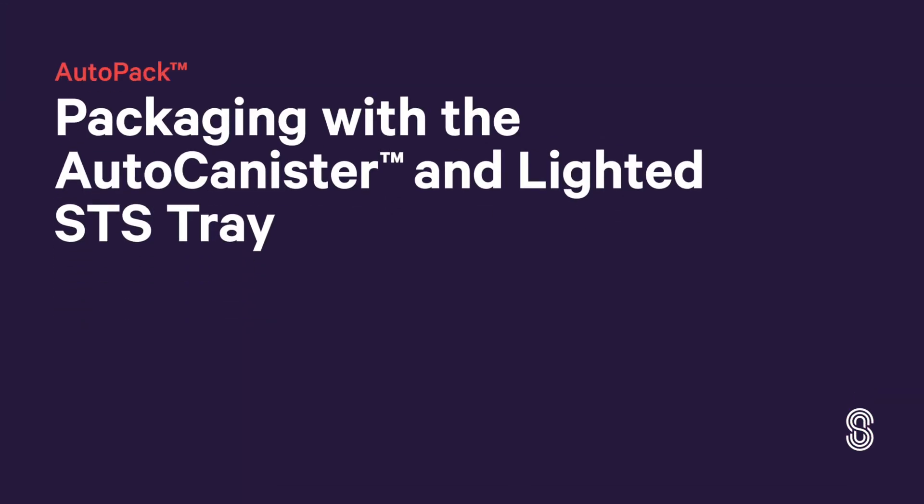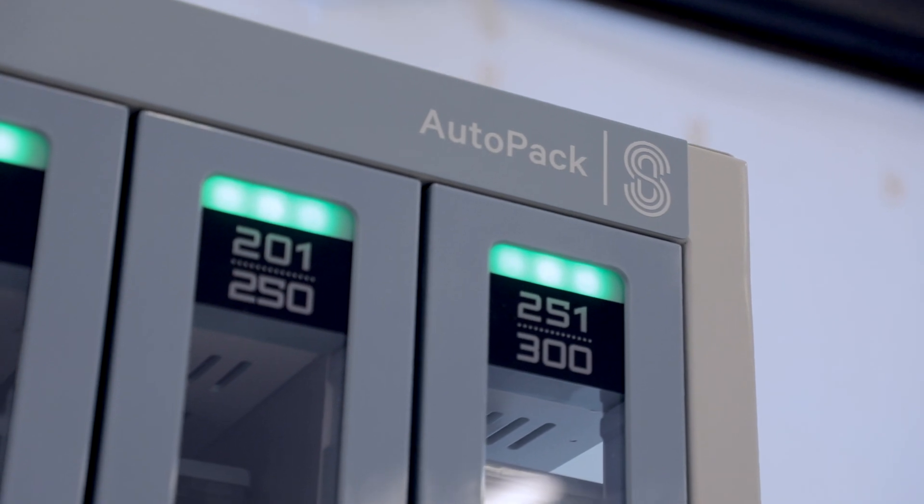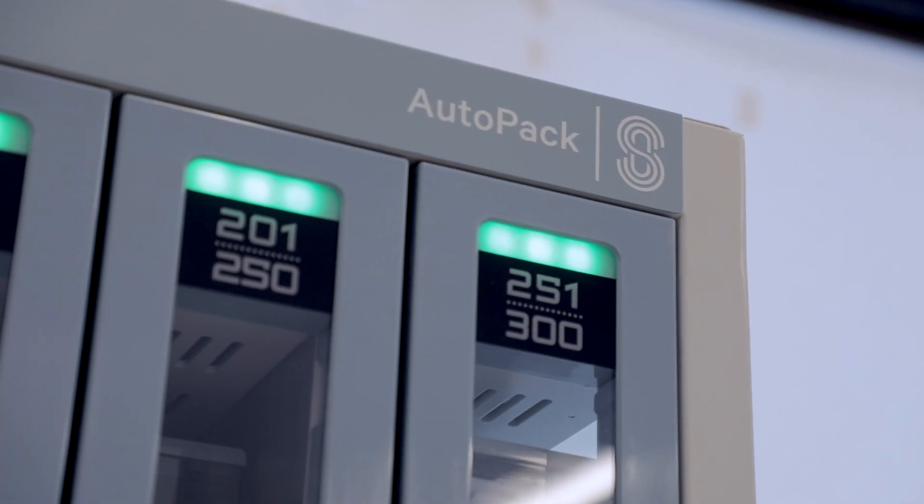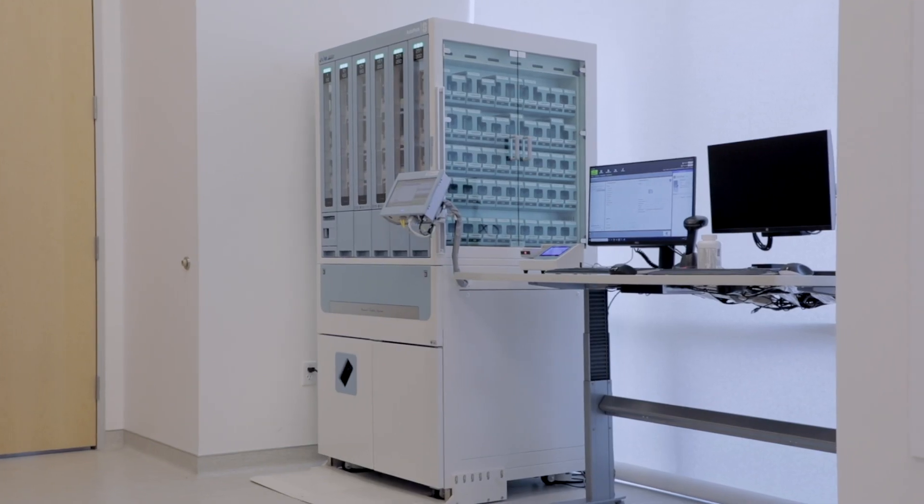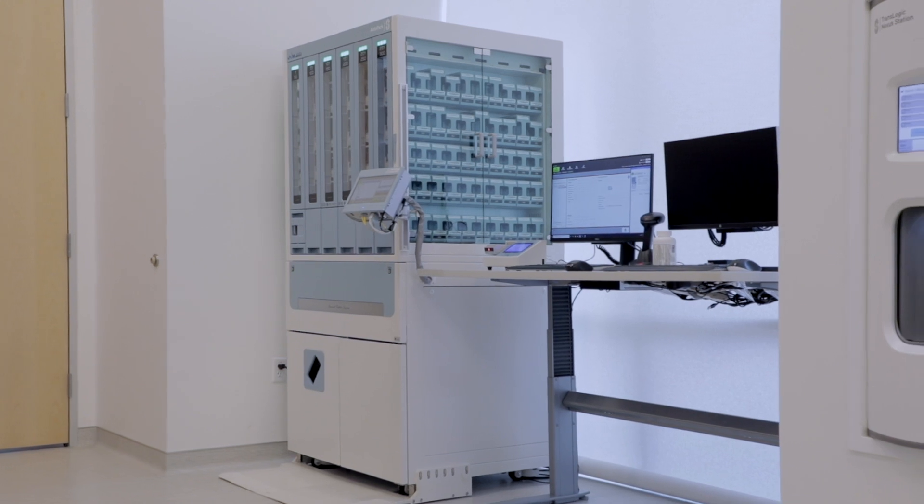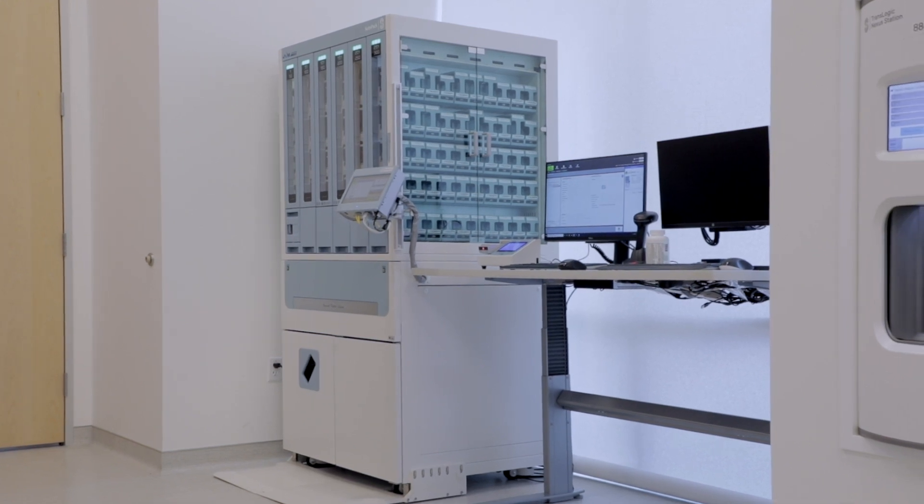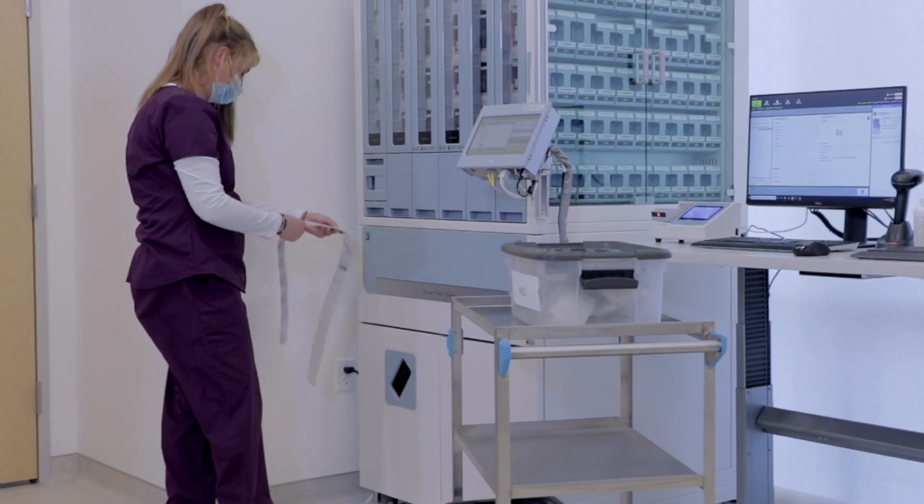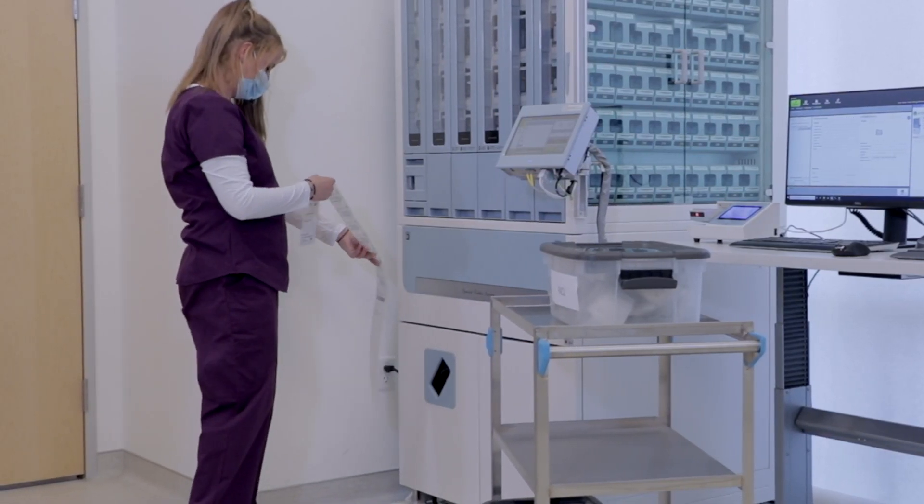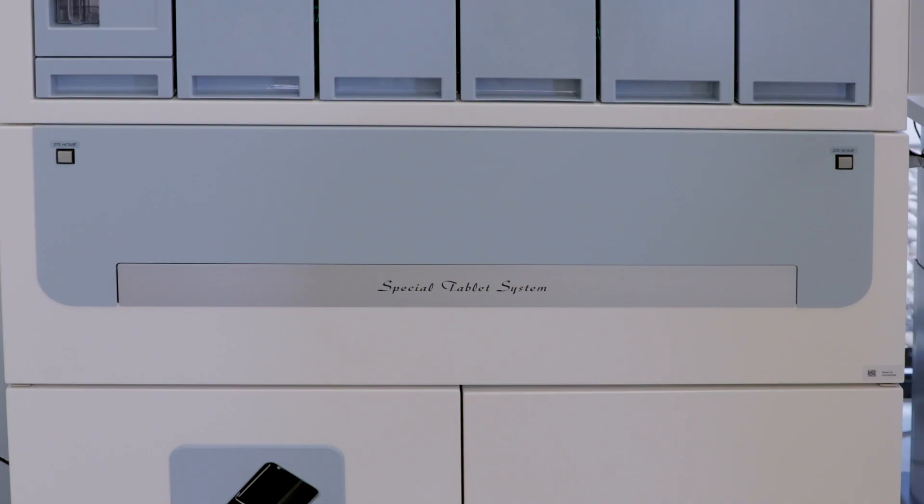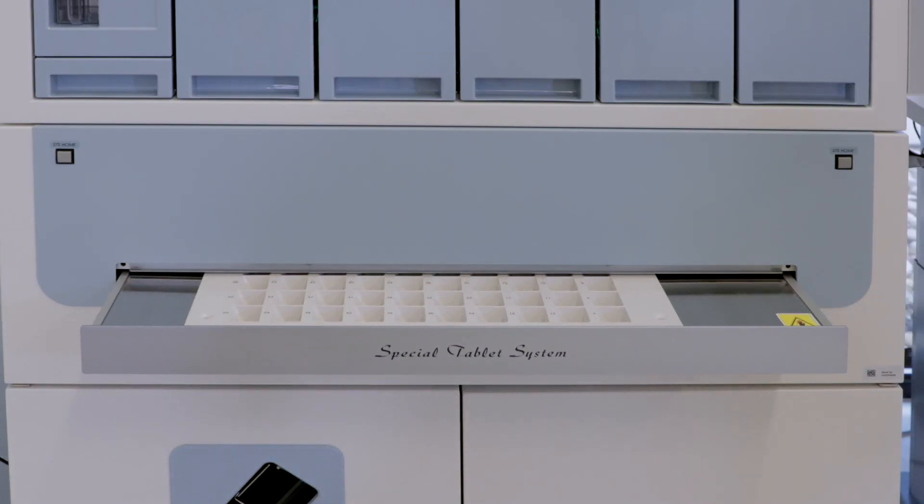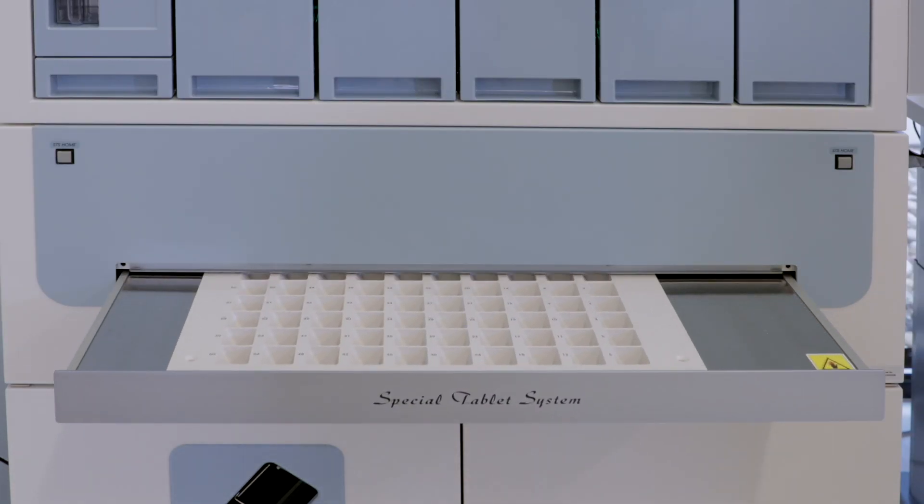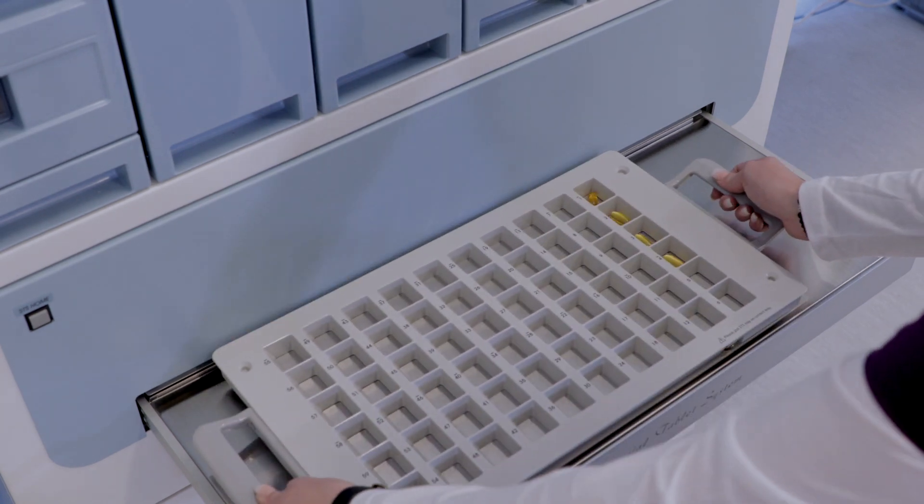The AutoPak Packager offers fully automated packaging for oral solid medications and integrates easily with your pharmacy operations to provide unit dose medication packaging, ensuring that 100% of medications are scan ready at the bedside. This video details the AutoPak's flexible packaging options to meet your varied needs.